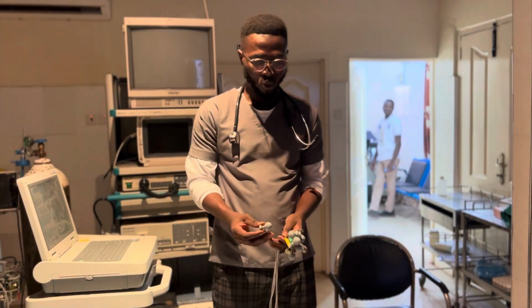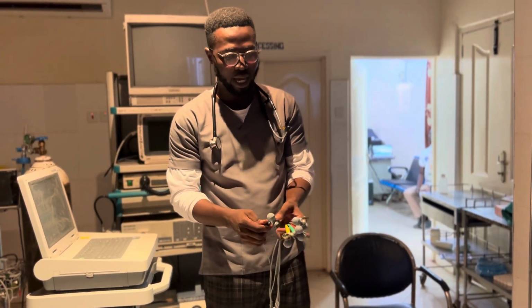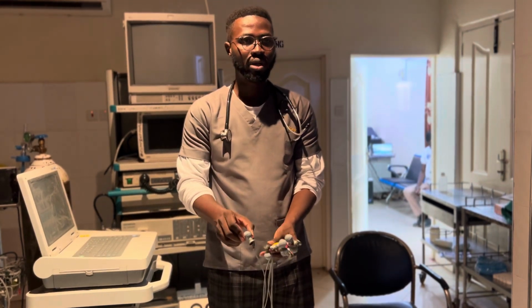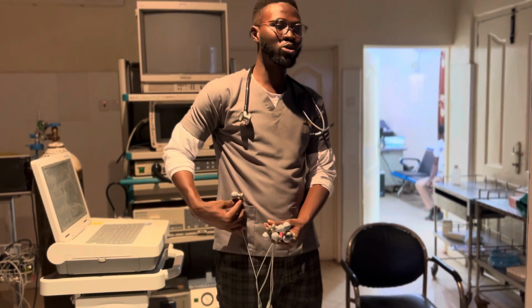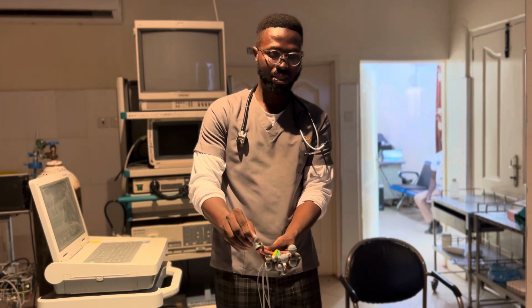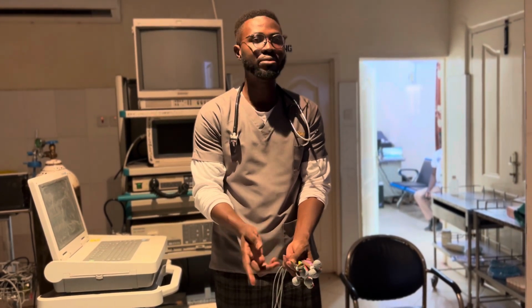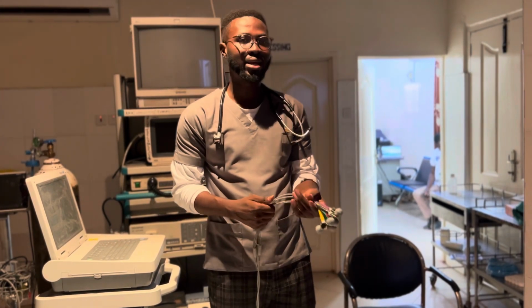Very good. So when I showed you the online picture, you see that these are actually the knobs. The electrode is actually connected to a knob. It is unlike this one that you can fit on the hand. So the question is, how do you fit it on the chest? You have to connect the wire to a knob. You can just press. Once you press, it sticks with an ultrasound gel. Do you get it? So these are the electrodes.